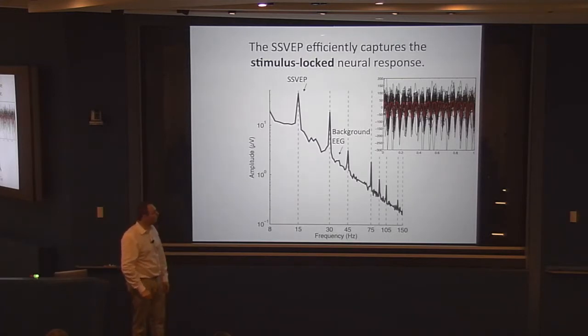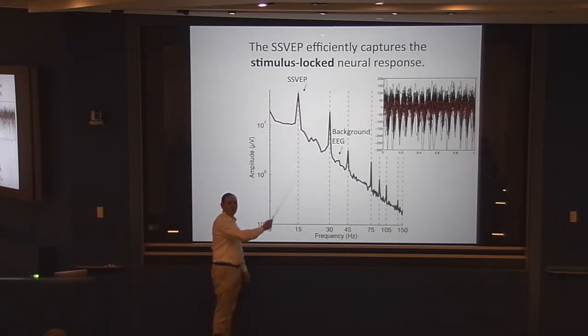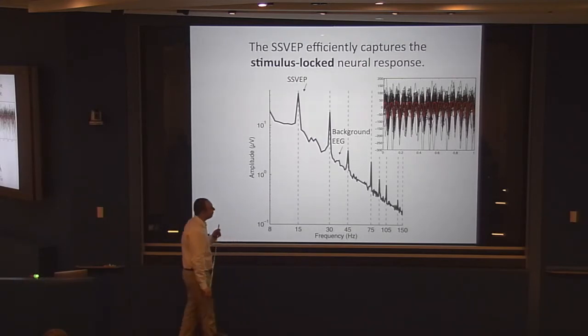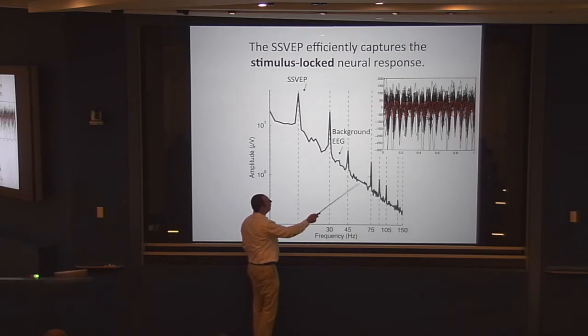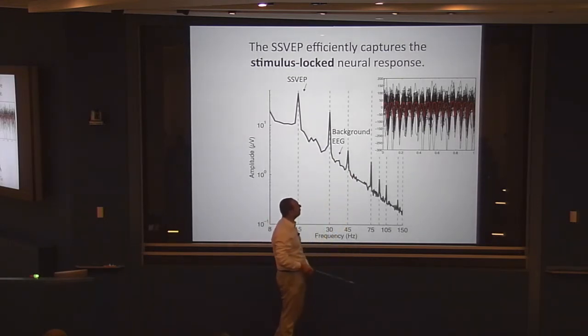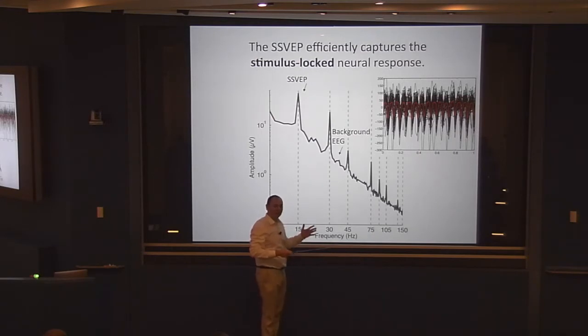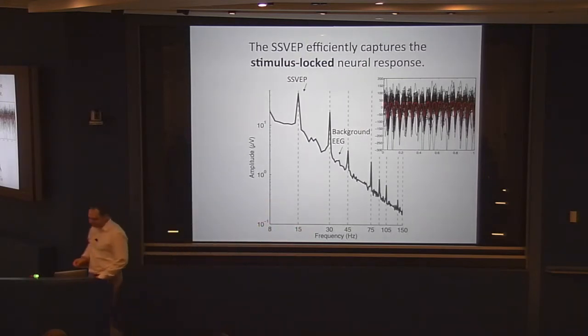And if you wanted to do something like estimate the exponent in this power law, you'd want to make sure you're avoiding electrodes, for example, that are sitting over vessels. And just to give you an intuition, by the way, for why we see these higher order harmonics, you can see that the actual time series is not a perfect sine wave. It's a little bit squarish, and that kind of squarish shape, loosely speaking, is what corresponds to these harmonics.